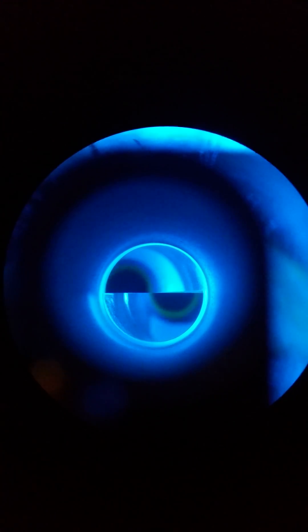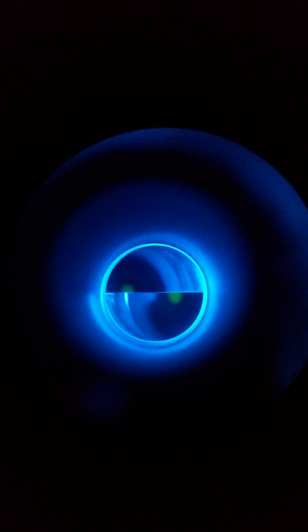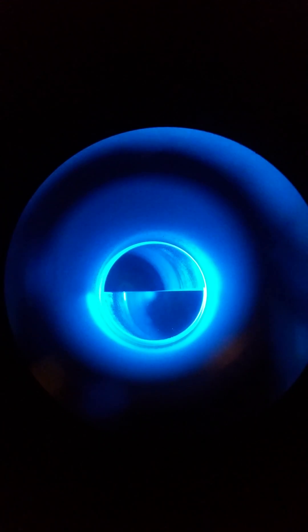There's your pressure and you're at 16. I'm just gonna move the green way down and way up. Put a little bit of fluorescein on there, wipe that off. Same thing — I'm gonna go high.